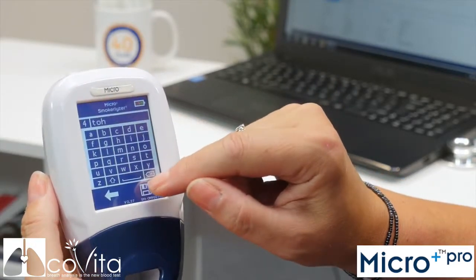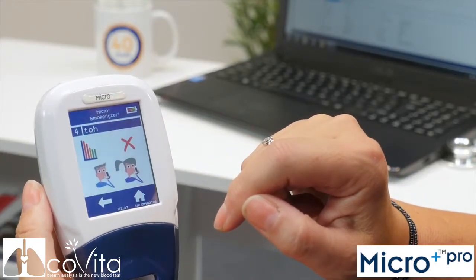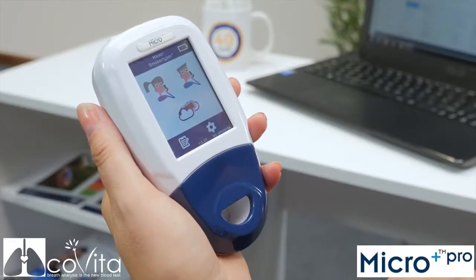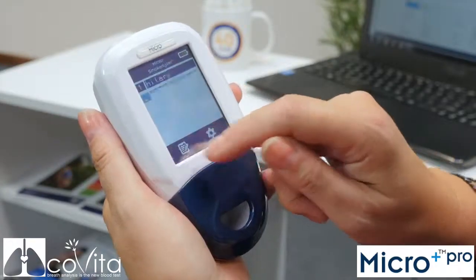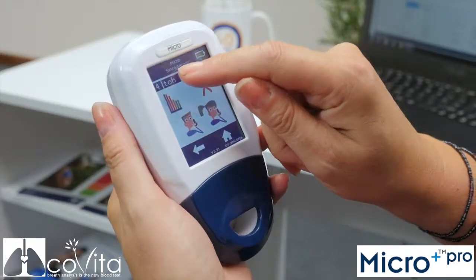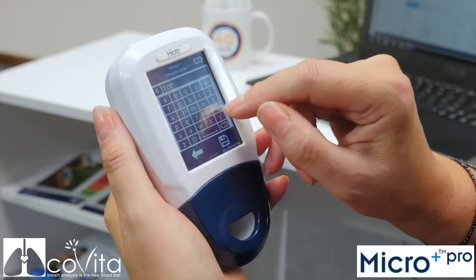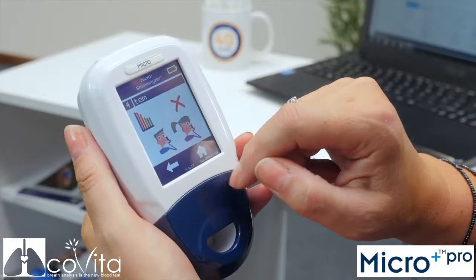Once you've entered this, click the Save icon to register the changes. You will now be able to see a graph of the patient's saved results. To edit an existing patient, click on the register and then select the patient you wish to modify. To change their name, click on their name at the top of the screen and use the keypad to edit. Once you are happy with the changes, click Save to register them or the back arrow to cancel them.